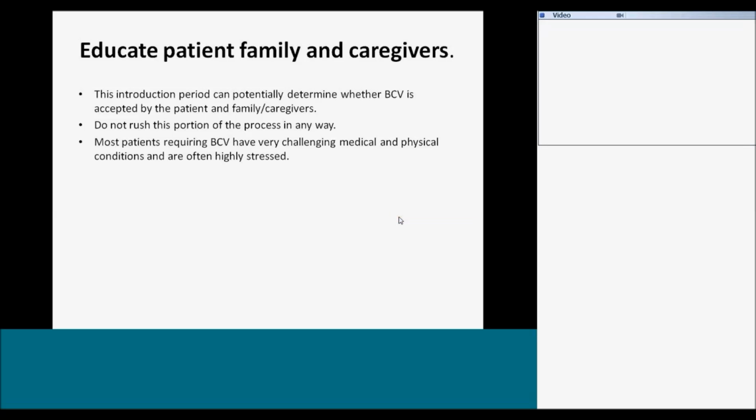Okay, now, something to bear in mind that's really important. The introduction period of the setting selection process can potentially determine whether the patient accepts the device. If they're frightened, and oftentimes these patients are really anxious, if it's frightening to them, then they may reject it. So you want to be careful. You want to proceed with care and with great sensitivity. So don't rush this portion of the process. Take your time with it.